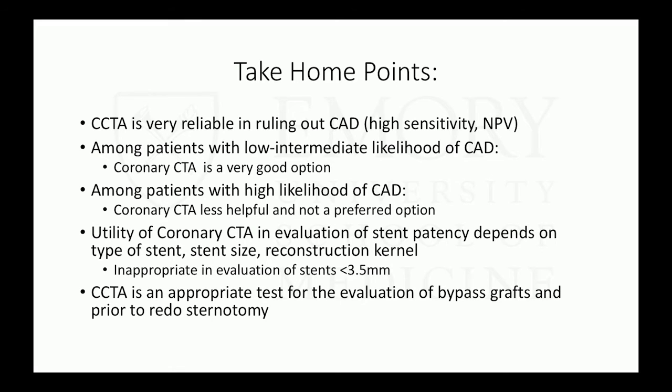And so my take-home points here: CCTA is a very reliable test in ruling out coronary disease, and we'll get to that more later as well. Again, it has high sensitivity and negative predictive value. It is a good option in those low to intermediate likelihood patients with concern for CAD. In those high likelihood patients, or someone that has multiple 2.5 by 2.5 millimeter stents, it's not necessarily the right evaluation. And I think it is a uniquely good test for evaluation of bypass grafts.